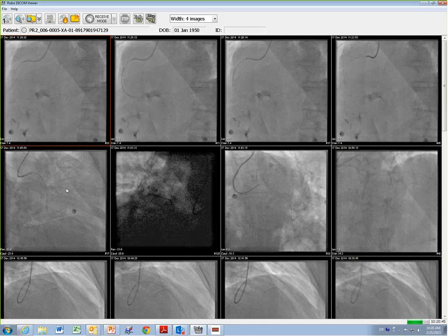The most common situation, if I look back on my experience, where I have problems is when the hematoma is going proximal. The distal hematoma very rarely makes a problem for me, but the problem is with the hematoma going proximal, which happens especially in the LAD, and then it runs into the left main and down into the circumflex, which creates a big problem. Sure, that's a very common scenario.